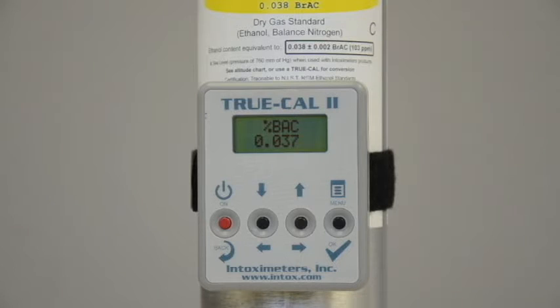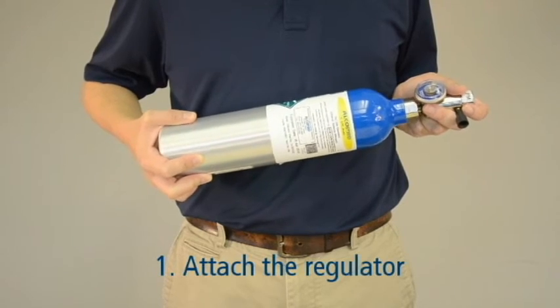Now that you know your expected gas value, you can proceed with a calibration adjustment. First, attach the regulator to the dry gas tank.